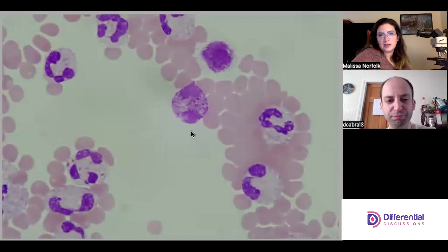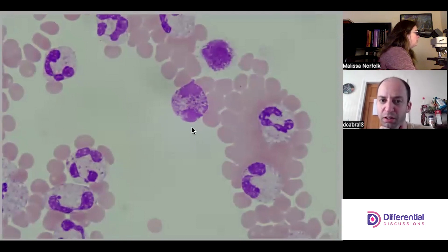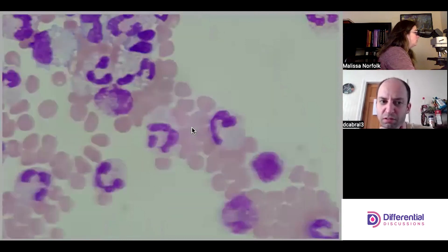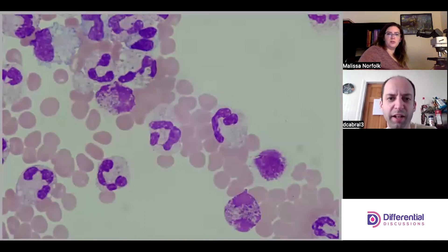I was trying to see if this was a basophil or just a cell that was smudging. My guess is smudging, but those do kind of look like basophil granules. Personally I would defer. But this cell here — it looks smudgy but it also looks like it has basophil granules. I buy that.